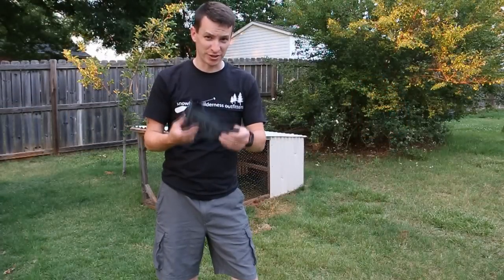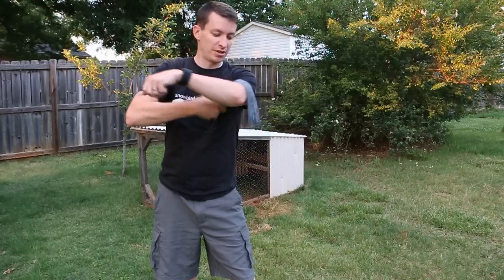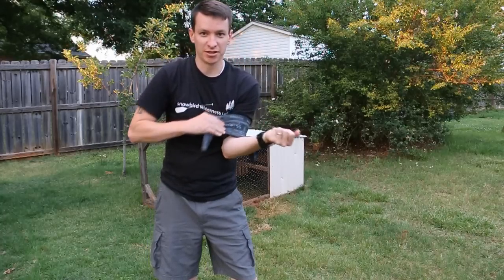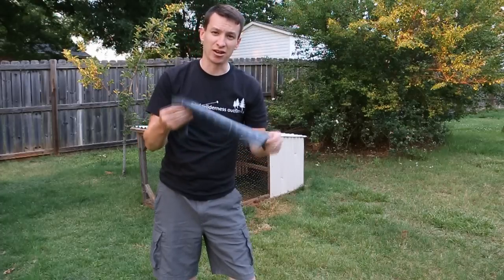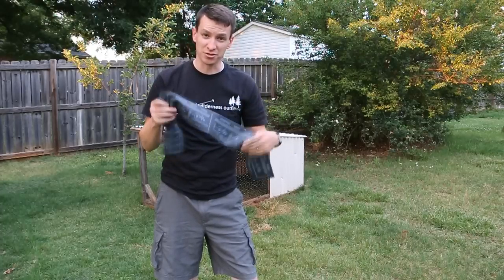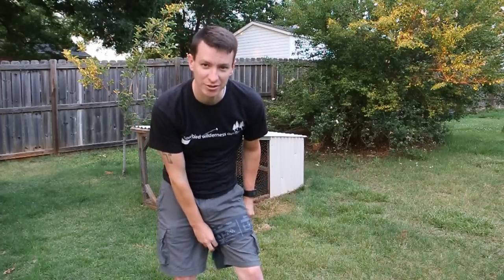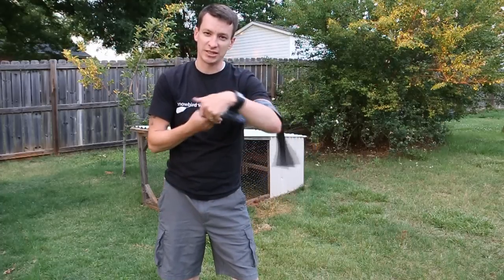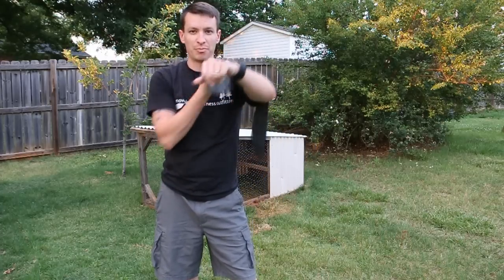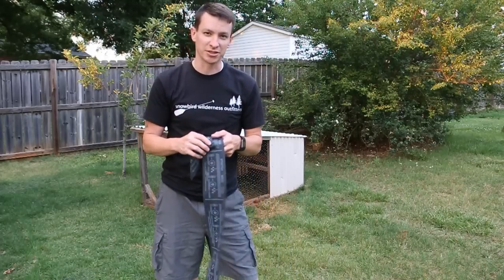This tourniquet is not good for self-application. I really like this tourniquet for buddy aid, but for self-application, you cannot get that first tuck done right — it's a lot harder. That's where the SOF-T and the CAT come into their prime for self-application. But for buddy aid, I really like this one. You know, if you're putting it on the leg you can do it yourself, but for an arm it's just really difficult. I'm not saying it's impossible, but there are other tourniquets that make self-aid easier.